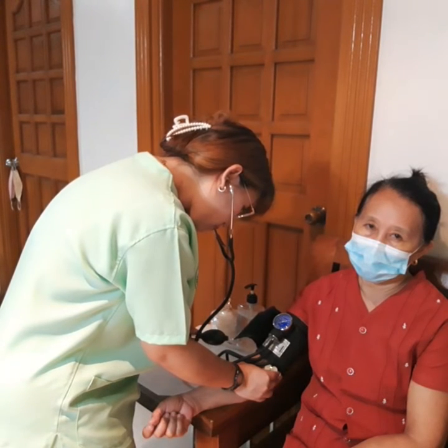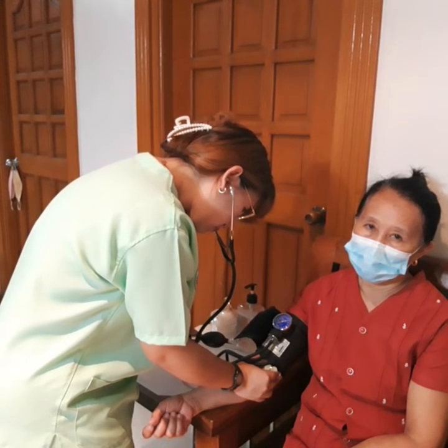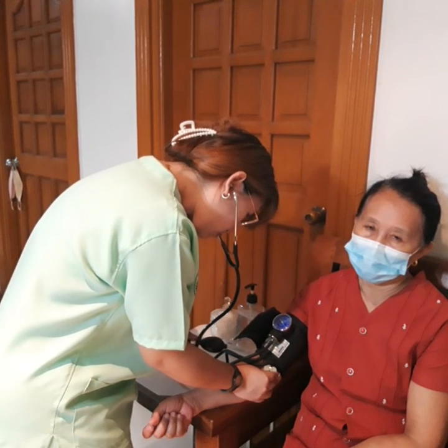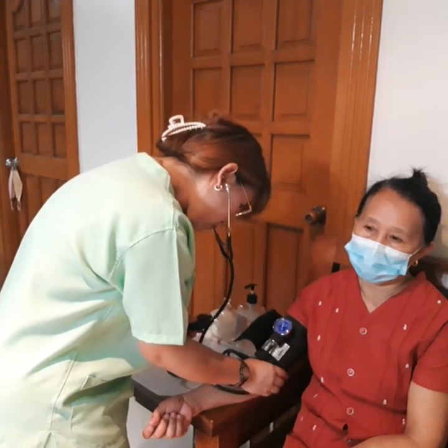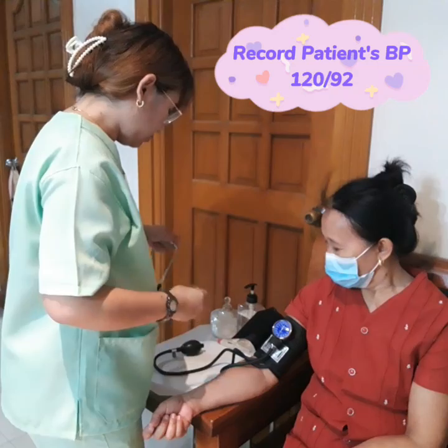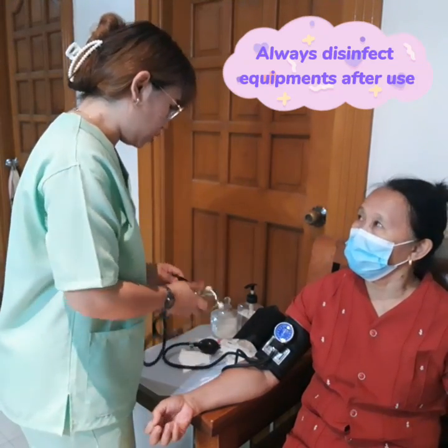Listen for the first heartbeat as you slowly release the pressure on the airflow valve. Note the reading on the gauge as the systolic, and the last beat is the diastolic. Allow the cuff to deflate and record the patient's blood pressure. Don't forget to disinfect the cuff after using.